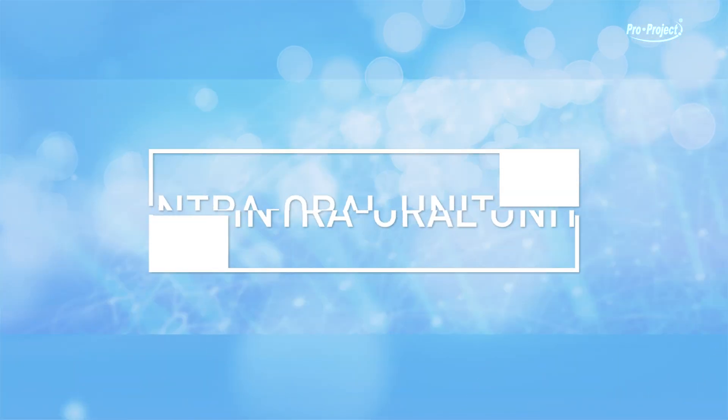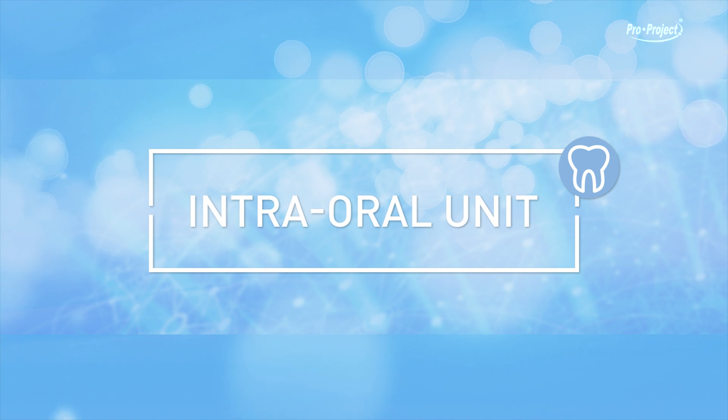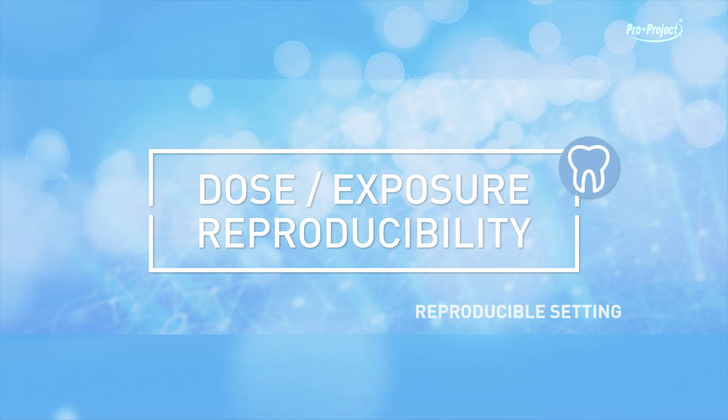Sensor intraoral unit. Dose exposure reproducibility, reproducible setting.